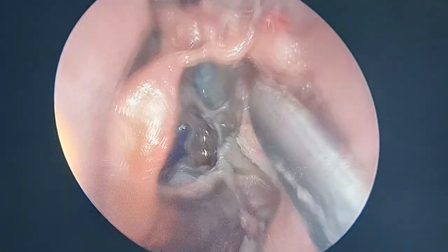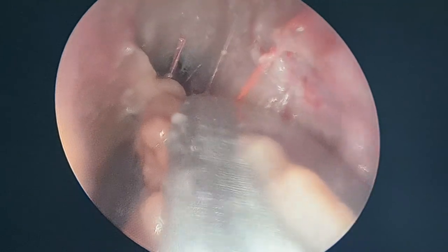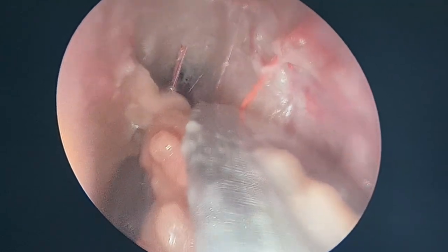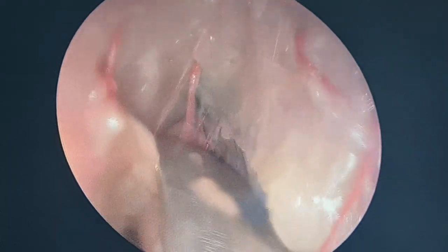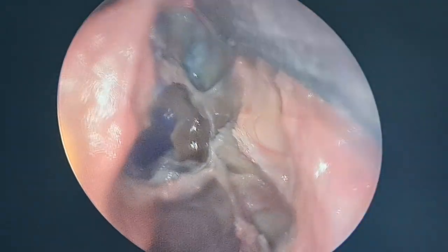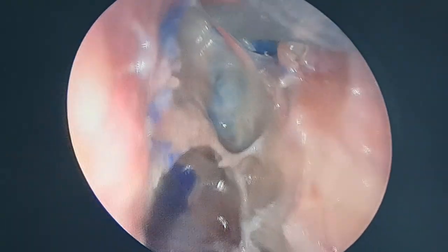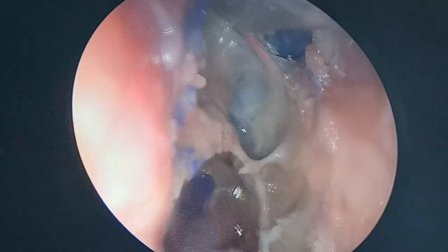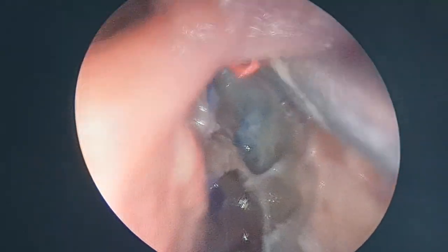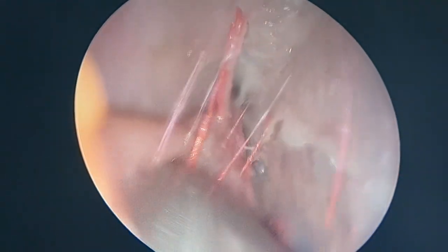See, what I am trying to show is, after elevating this flap, this bone we have to drill. That is the beak which we have to drill in the Draf. And with this flap we have to raise, and the posterior limit of the Draf we have to define so that we don't damage the olfactory fiber or the skull base. So see, this lamina, this is the vessel going to the lateral lamella. My first olfactory fiber is going to be there, and how is it defined?